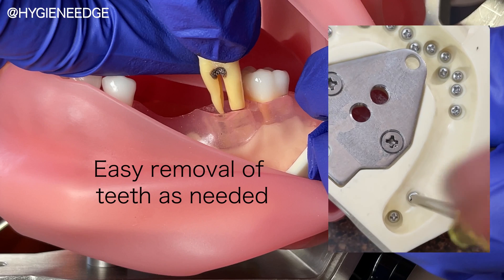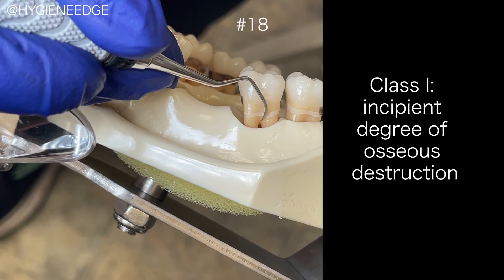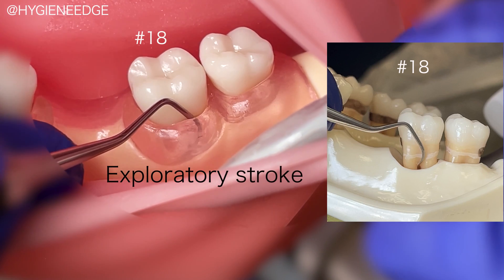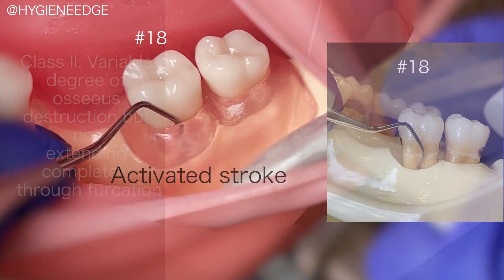Furcations on mandibular molars are located on both the buccal and the lingual sides. If the furcation is a class 1 with just that initial anatomy exposed, you could perform a horizontal stroke for calculus removal. This is helpful to access that small indentation that can now easily harbor deposits.